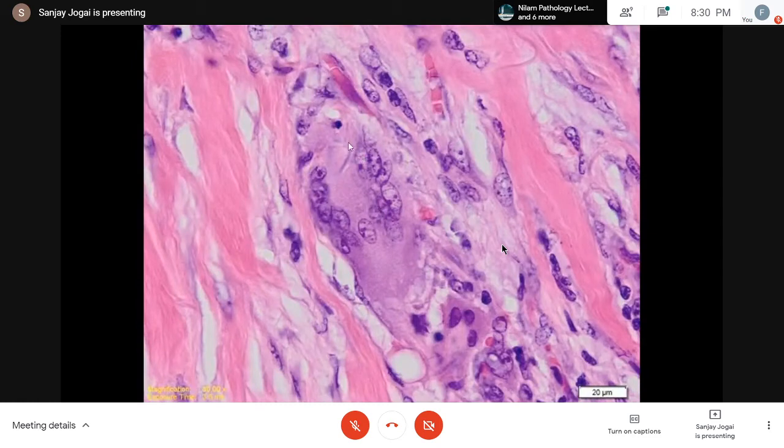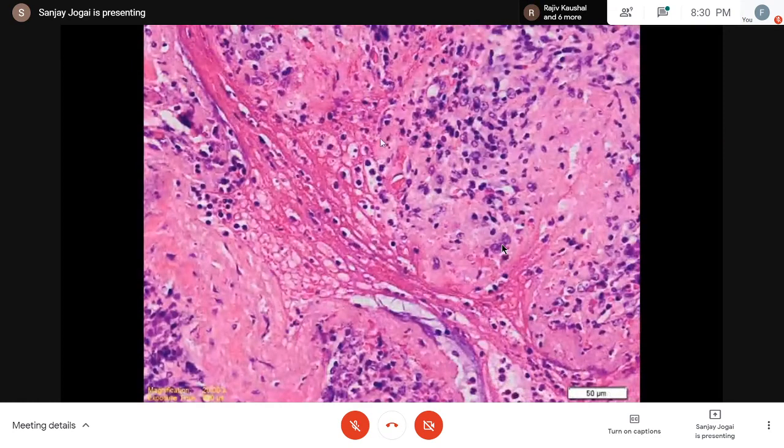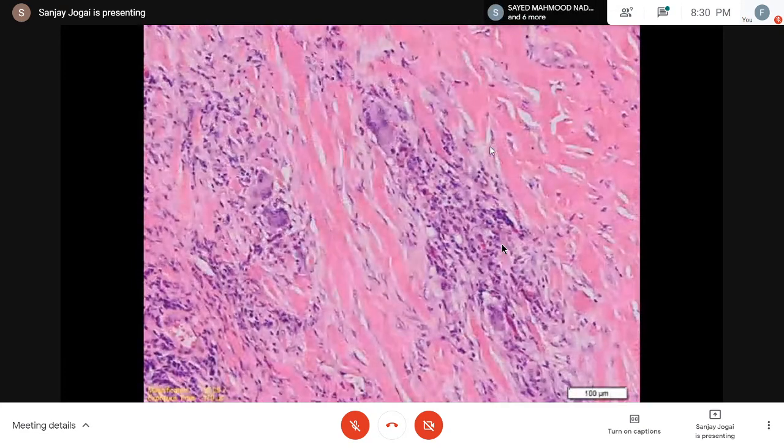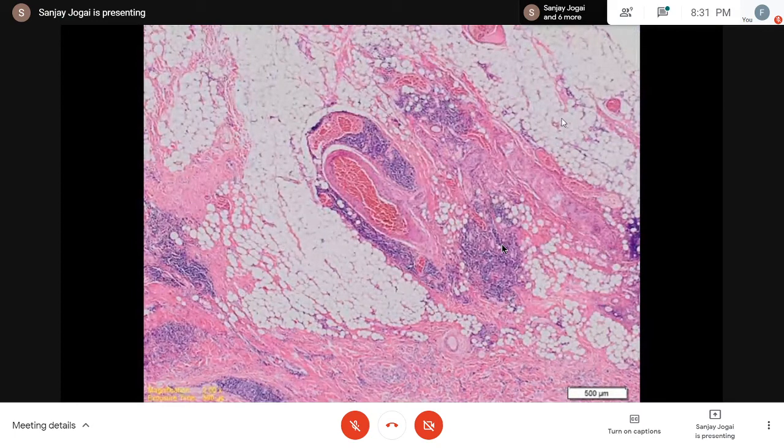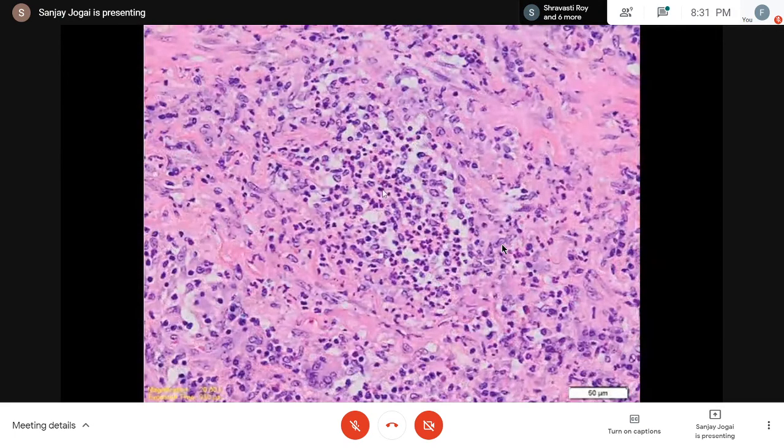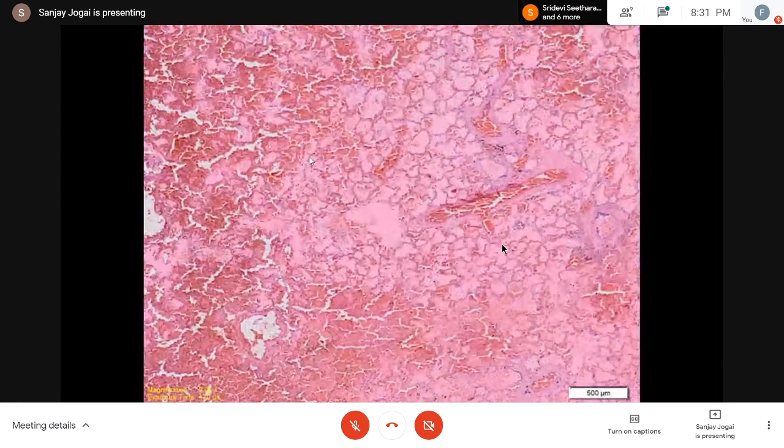Look at these giant cells on a close-up, elastic fiber ingested. And in some areas, there was a bit of karyorrhectic debris as well. Again, quite a few giant cells, and it was extending into the periarteriolar area within the fatty tissue as well, with inflammatory changes and very occasional aggregates of neutrophils. The background lung was just very hemorrhagic and congested. I didn't see any tumor. There was no evidence of a sarcoma.